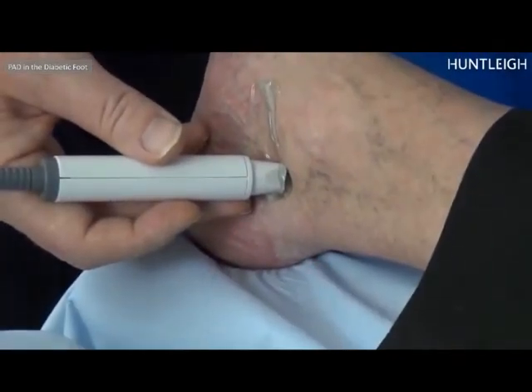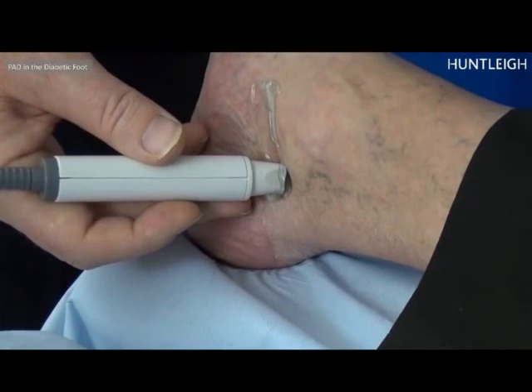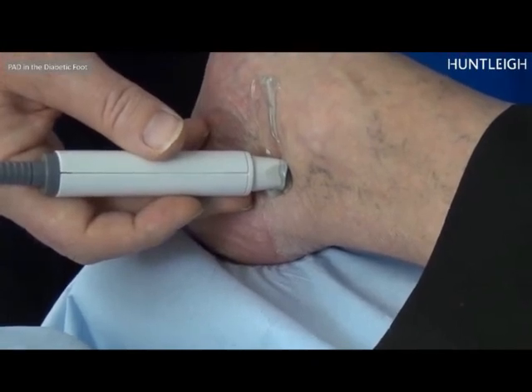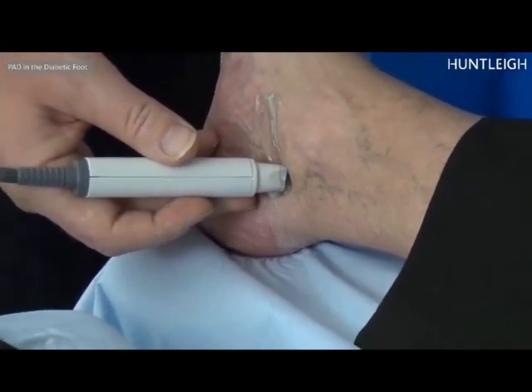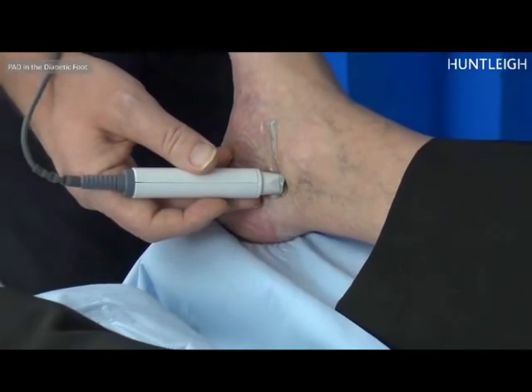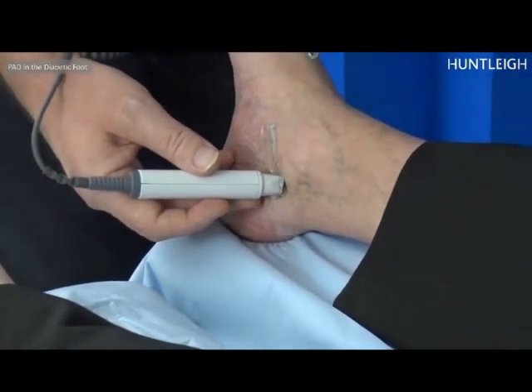Record the palpability of both popliteal and femoral pulses and use in conjunction with the foot pulses, Doppler waveforms, ABI, TBI and clinical presentation to help develop the clinical diagnosis and treatment plan.